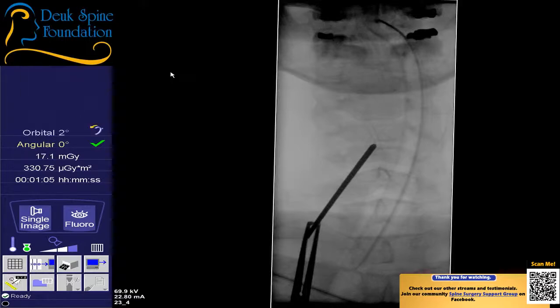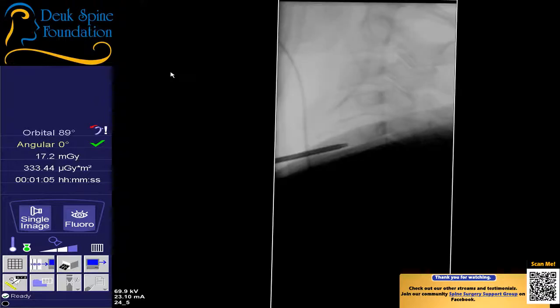By the way, we've had one drop of blood, in case you're wondering. One drop, maybe a drop and a half. I'm kind of looking at it right now. Is that lateral? Huh, interesting. Stay there. Boy, her shoulders come up high. Shot? Is her paralytic wearing off?